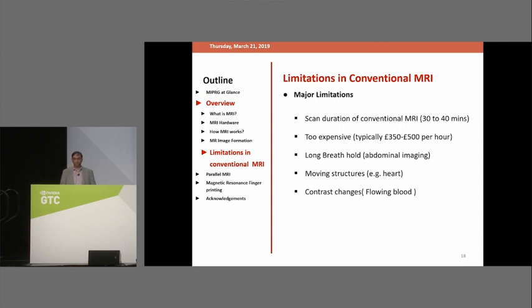Major limitations of MRI are that it becomes too expensive because we are spending too much time with a patient lying in the scanner. Obviously, it costs a lot of time and a lot of money.